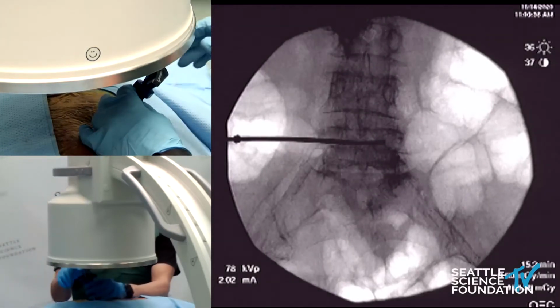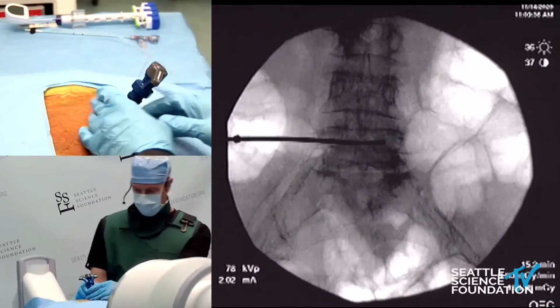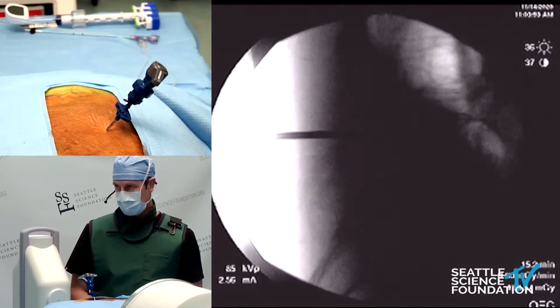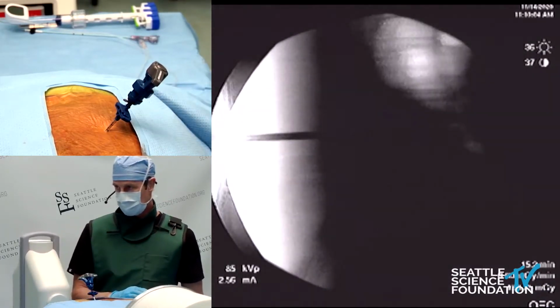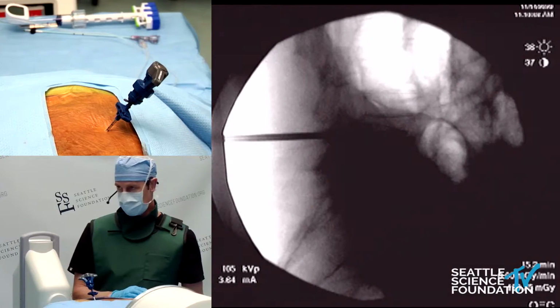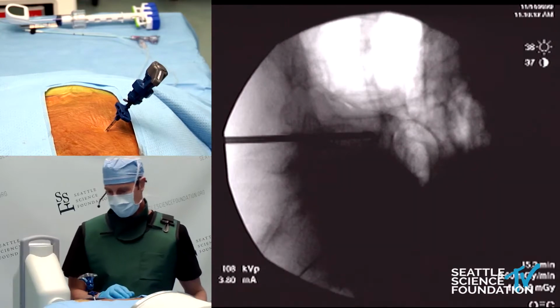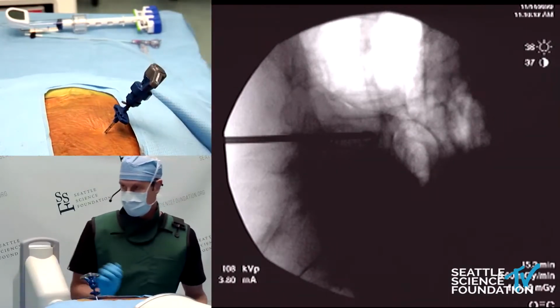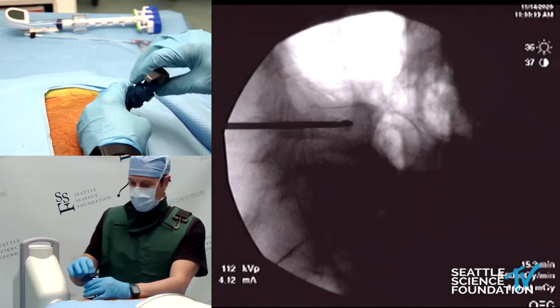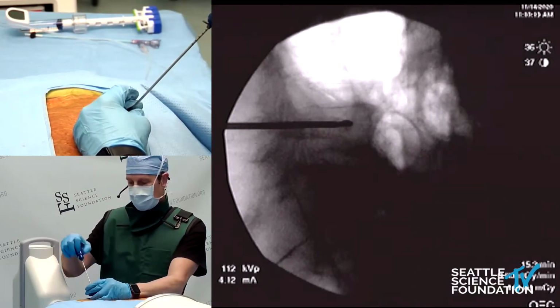So what we'll do is we'll switch back to the lateral, and I'm going to record this for posterity's sake. We'll take a shot there. Drop it down a bit. There we go. Better, okay. So that will be the final position of the balloon. And so I'll go ahead and take this out by rotating counterclockwise on the curve. And we'll take it out, remove it.